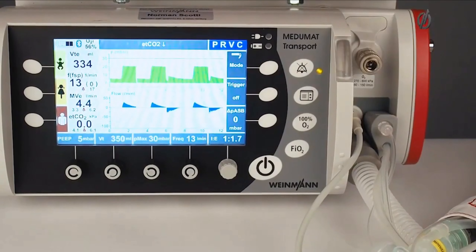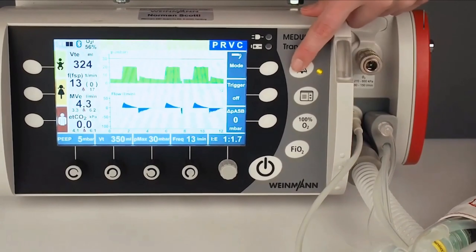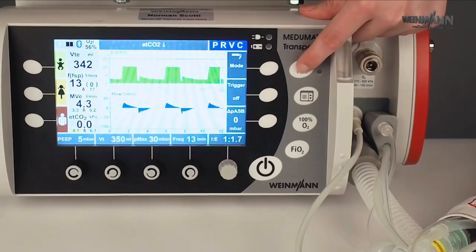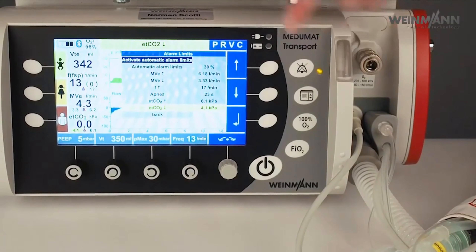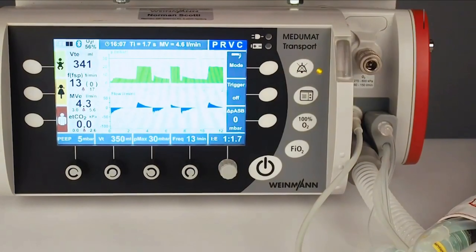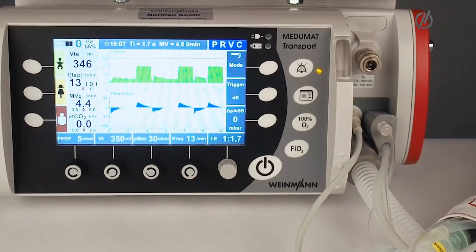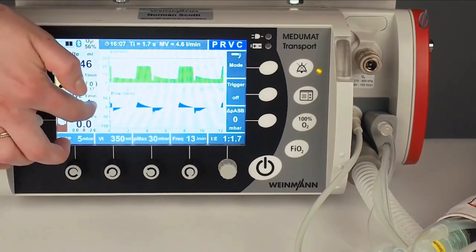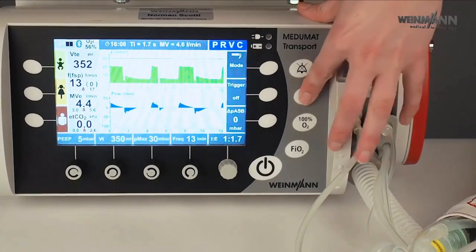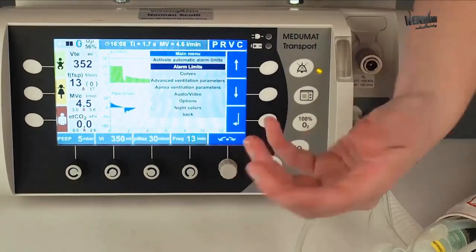The alarm mute button will mute all alarms for 120 seconds. Pressing long on that button will open the alarm menu, and with one click I also have the possibility to automatically activate the alarm limits — the device calculates the alarm limits based on the current measurement value. Here I have the main menu of the device, which also includes an alarm limits menu.